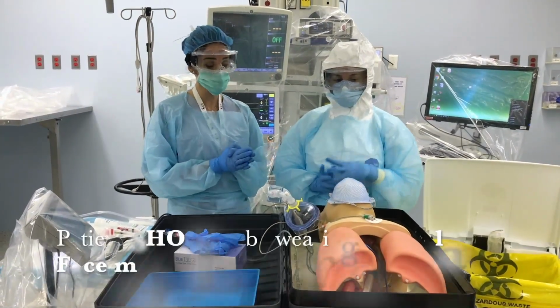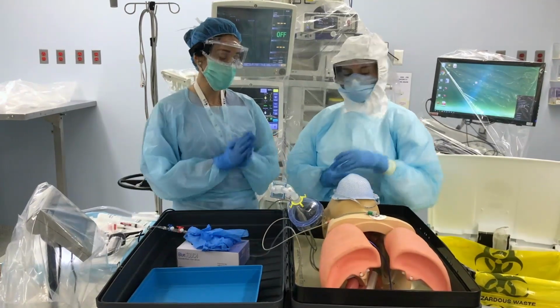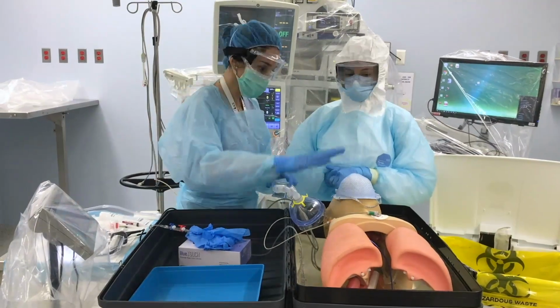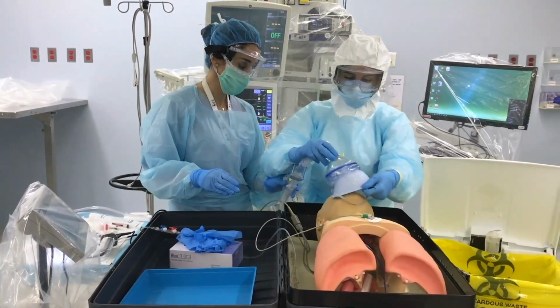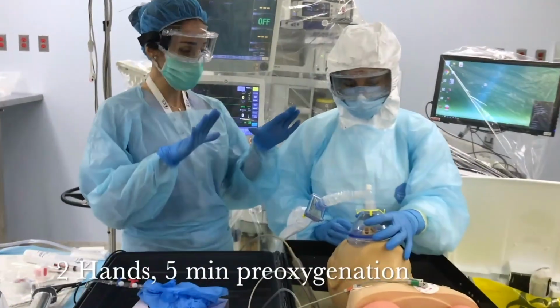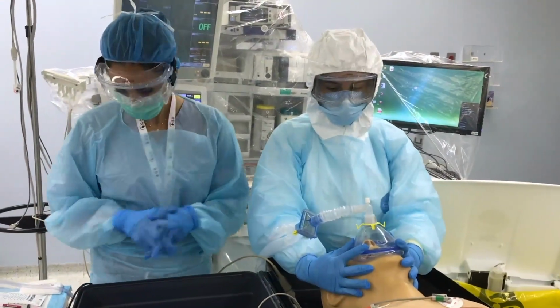Patient will present to the OR with a mask. Then we're going to apply the monitors, and we're going to be ready to start soon. So we're going to remove the mask and apply another mask on it. We're going to ask you to take a few deep breaths in and out. So we're going to apply the two-mask seal just to prevent any leakage, and I'm going to induce.